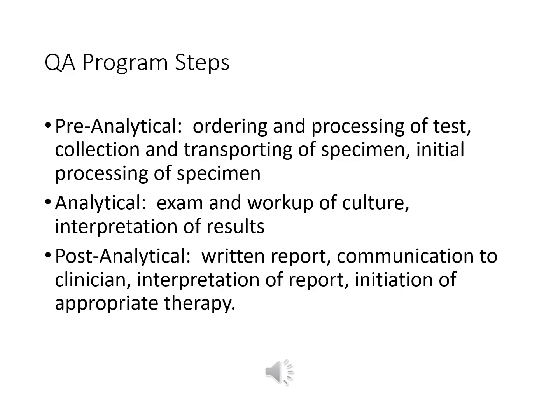Analytical is when you are actually reading your plate and doing the workup off of that culture, as well as the interpretation of the results. So the identification of the organism, reporting of the susceptibility testing, those types of things. Post-analytical is going to include the written report, the types of communication to the clinician, how the clinician will interpret the report, and also initiation of appropriate therapy.